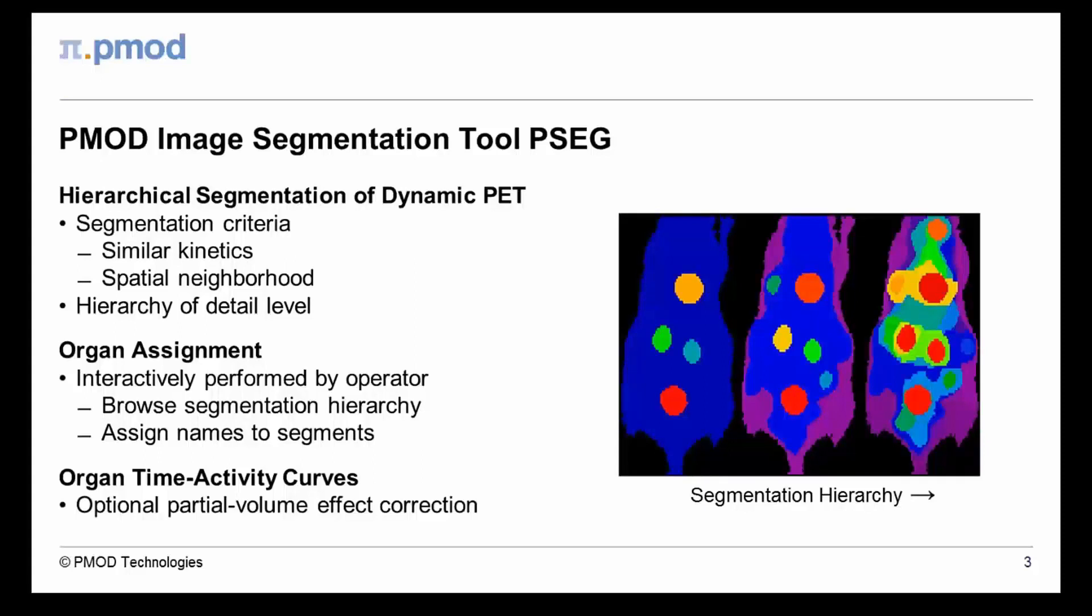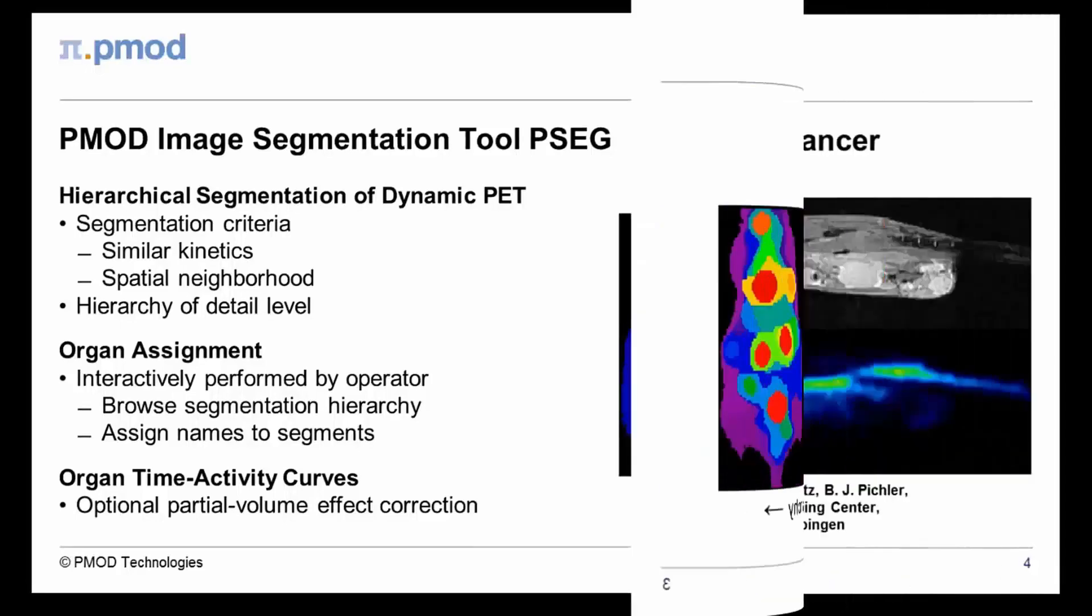They grow towards higher levels and become kinetically more variable. The user needs to browse through the hierarchy levels and assign labels when a segment corresponds to an entity of interest, such as an organ or lesion. Once all relevant objects have been assigned, their PET uptake curves are readily calculated, with the possibility to correct for the partial volume effect.